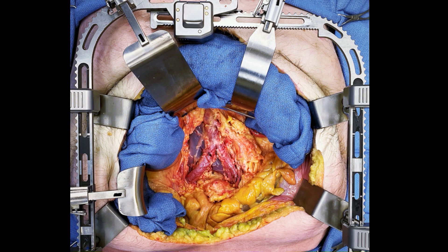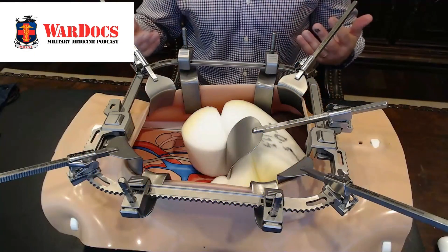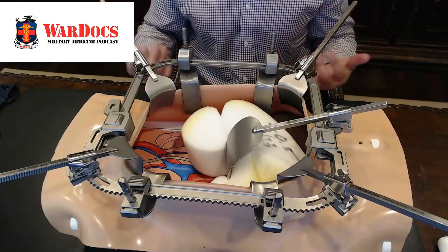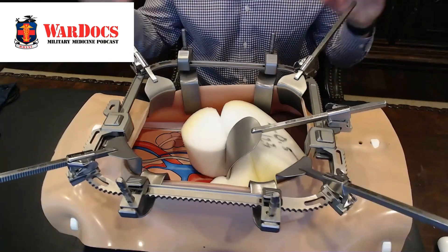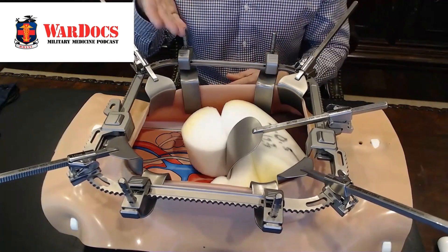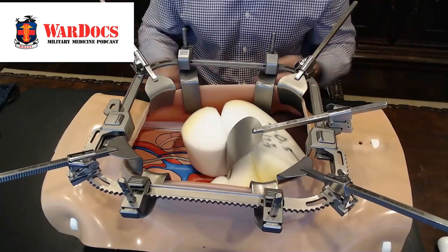So now I can get to the retroperitoneum in about 90 seconds, where it would normally take me 10 to 15 minutes for the Bookwalter setup. You can use this in the ICU. You can use it in the trauma bay. And in an austere environment where you don't have the option of a Bookwalter rail or the bed rail, this is the exposure you can get by yourself in a combat environment.